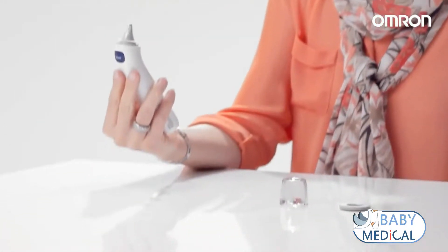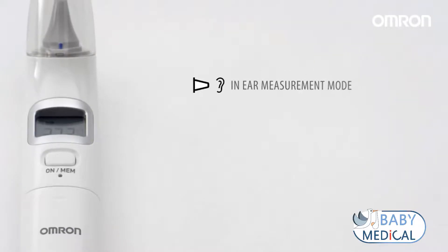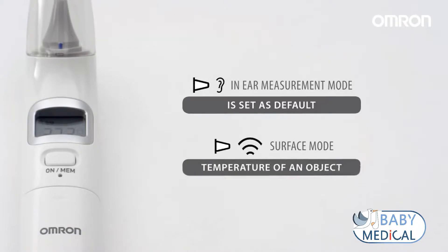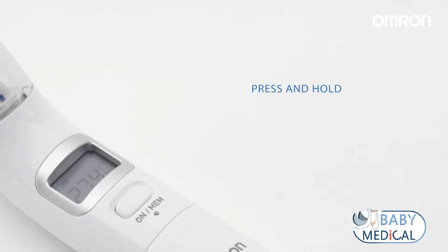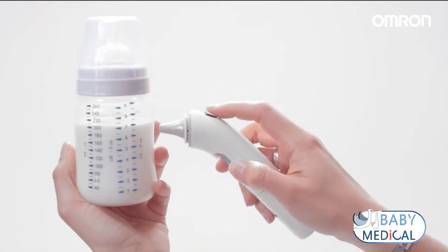After one second, the measurement is done, indicated by a long beep. In-ear measurement mode is set as default. The surface mode can help you understand the desired temperature of an object. Press and hold the ON MEM and start button simultaneously until the surface temperature symbol appears. Measure the surface by pressing the start button.